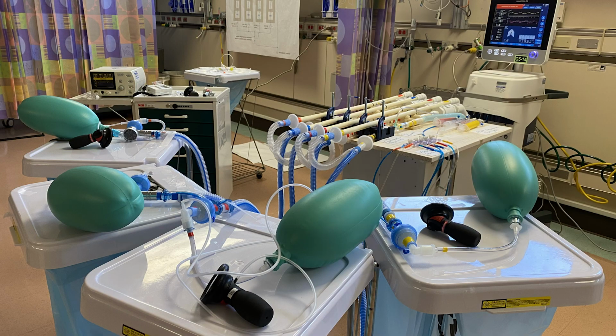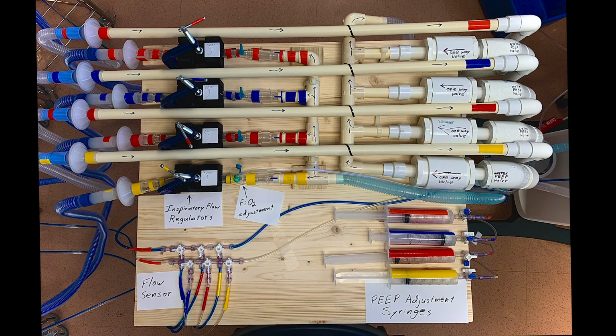The assumption is that you've already seen the previous video entitled Quad Split Ventilation System Update 01. So this is update 02 to that system, just explaining some of the new understandings and advancements that we've made with the quad split ventilator system. This system allows you to ventilate four patients with a ventilator, each requiring a different minute ventilation.